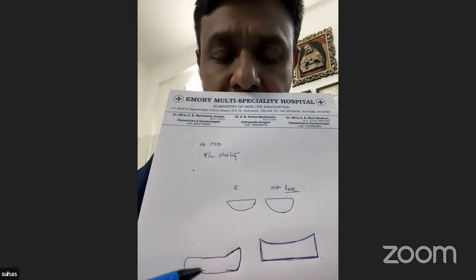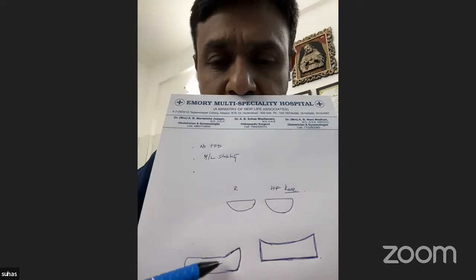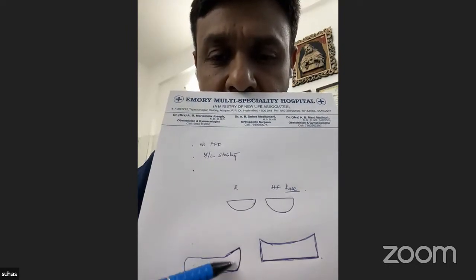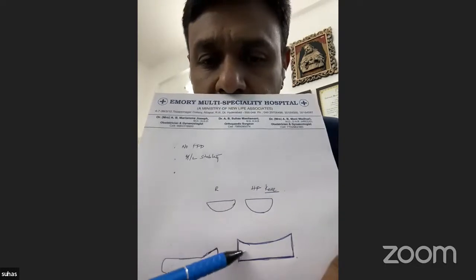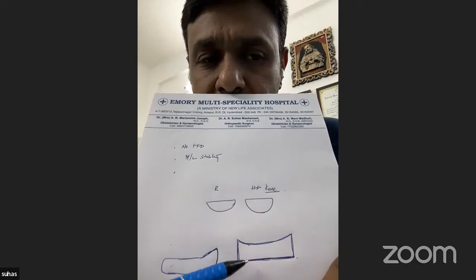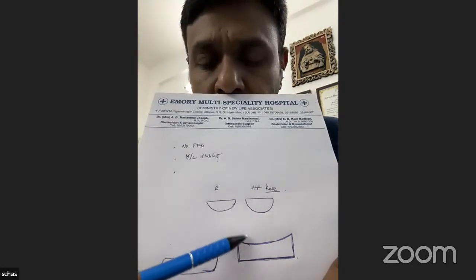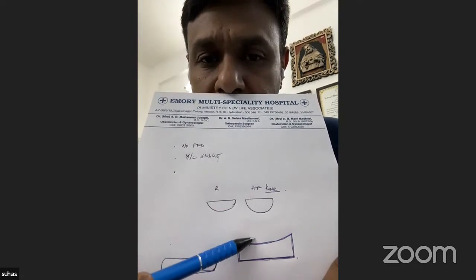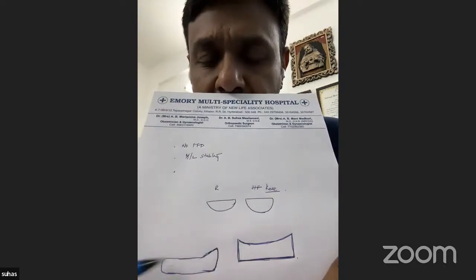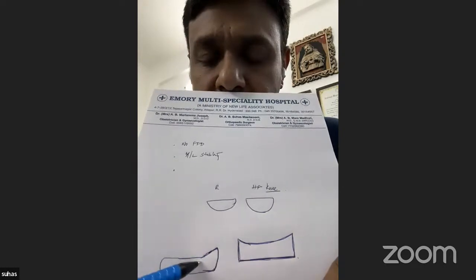So deep dish, as Sir said, is used where you've pie-crusted your PCL and you realize that maybe you've done more than what's required and you need an anterior stop. Okay, so that's a deep dish versus a mobile bearing, which is usually cruciate sacrificing. You already removed your PCL. Your whole stability is coming from the femur matching the polyethylene. So this is the whole concept of kinematic conflict. So this is deep dish and this is the mobile bearing and this is the deep dish.